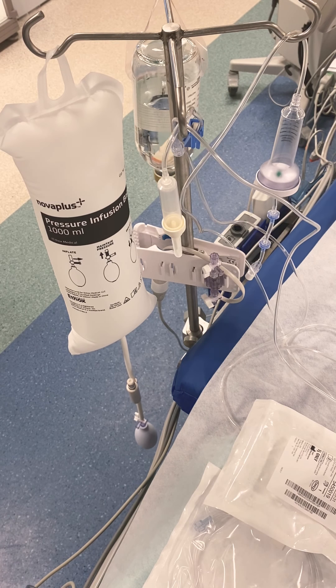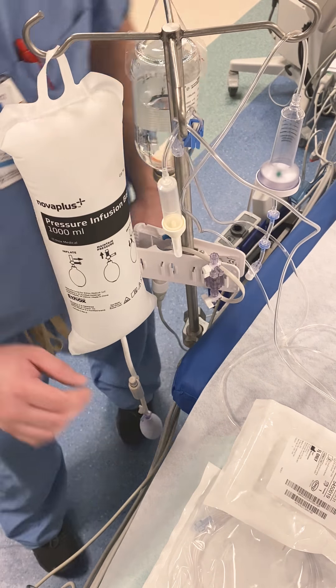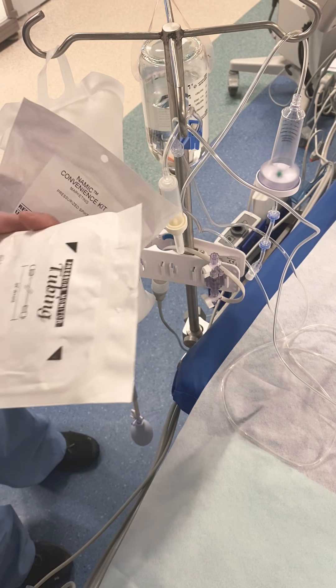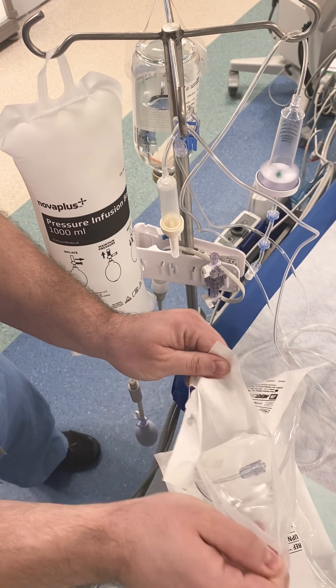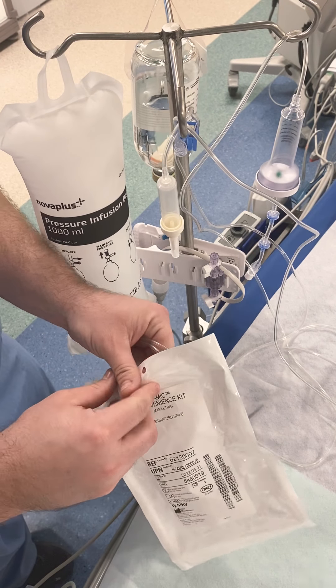This part covers the transducer setup in your pressure bag on the circulator side. The other two packages shown in the previous video are the convenience kit and a male-to-male extension tubing. The package may always change depending on availability.